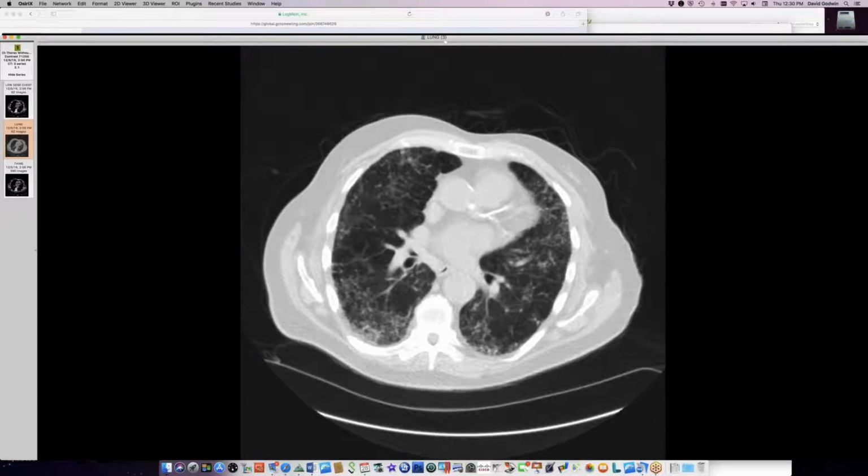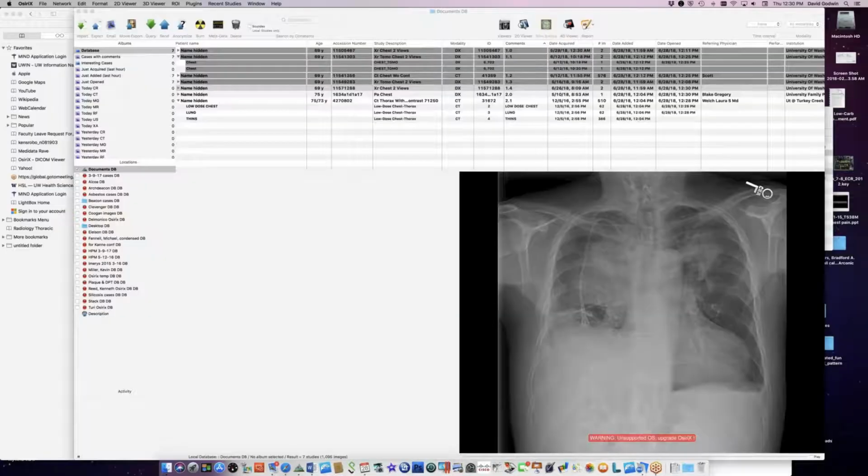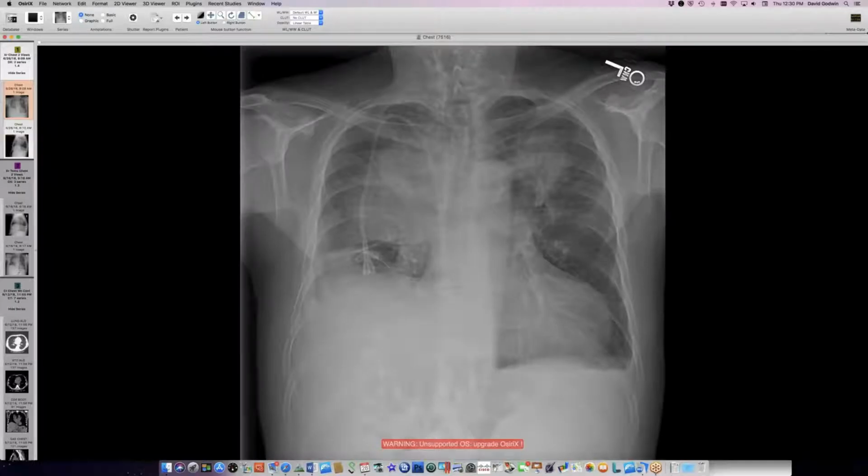Excellent. So those are my cases. Okay. David, I was going to comment about your first cases. I'm trying to recall if I've seen a case of bilateral mucor. Usually you get a single large infarcting looking mass and maybe some satellites, but I don't recall seeing that extensive bilateral lung disease. That's because sometimes they have to resect it because they can't clear it. Right, but they can't resect it if it's in more than one place. And we have, I'm sure, seen cases where it was in more than one lobe.